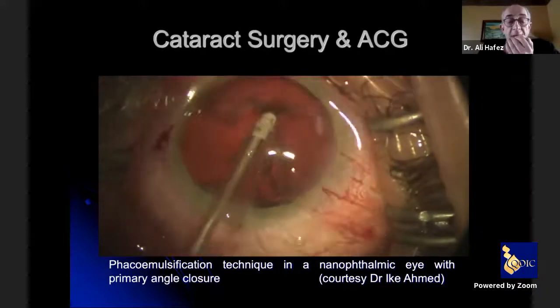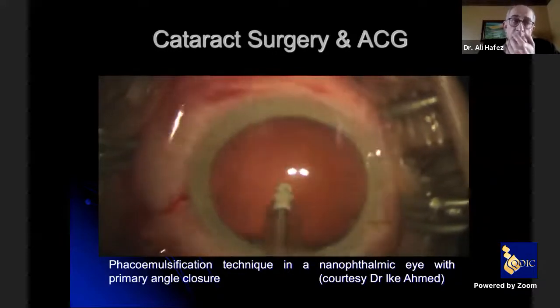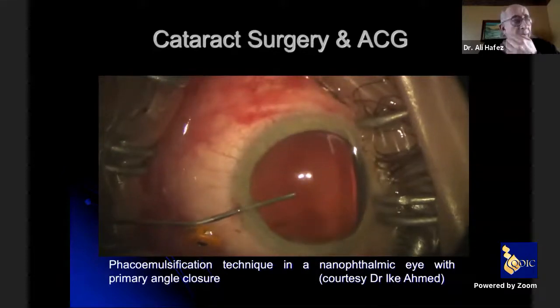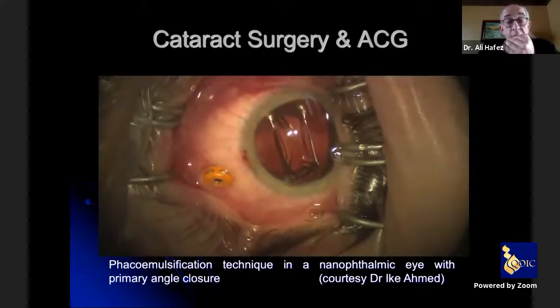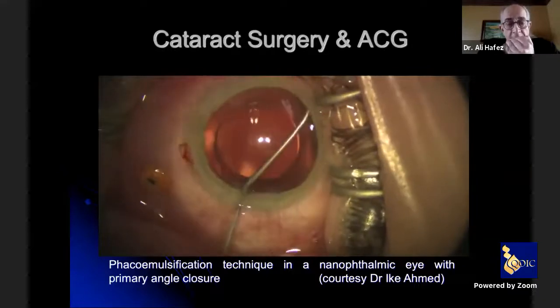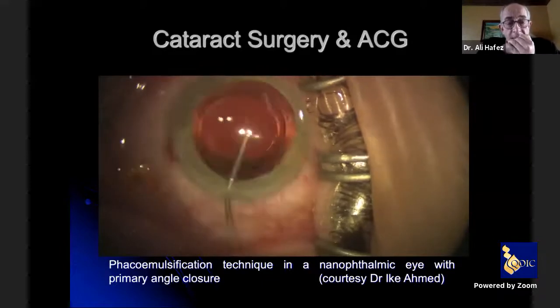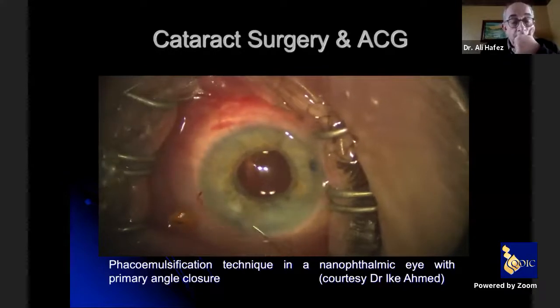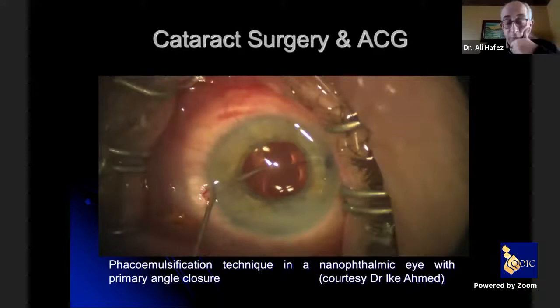Cases of nanophthalmos are known for two major problems: exudative detachments, either hemorrhagic or serous, and the other problem would be aqueous misdirection. So every time an instrument is removed from the eye, a reformation of the anterior chamber should be maintained. The lens is placed, the wound is closed with Prolene, and the case is completed with no problems.